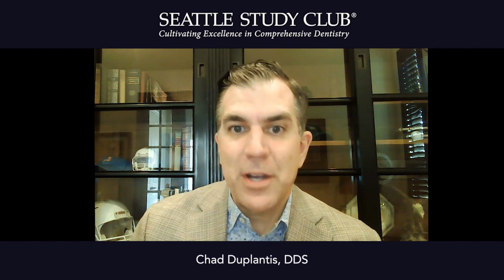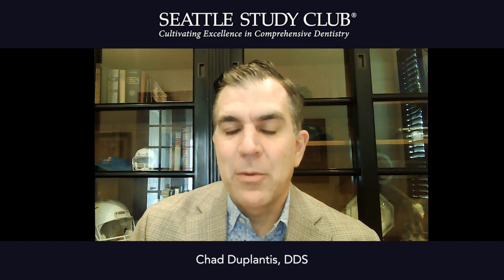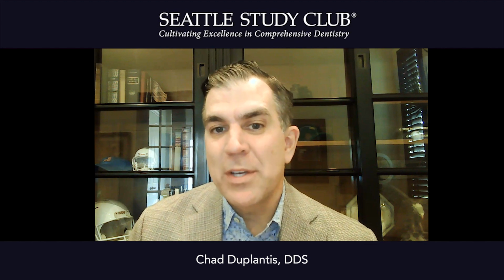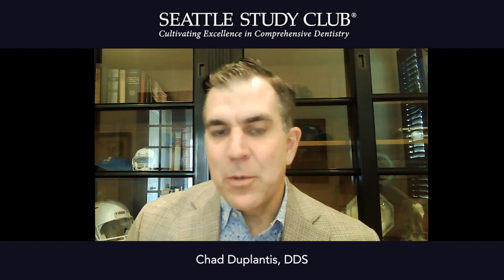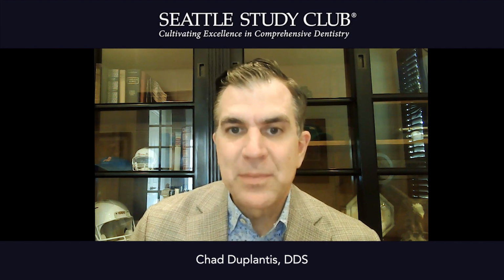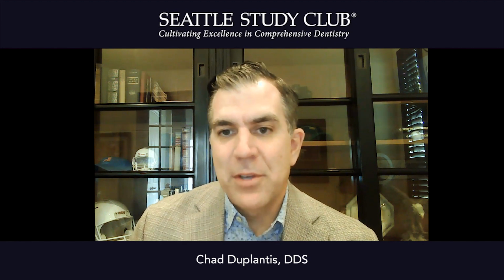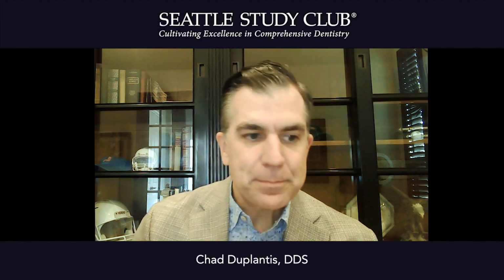The A stands for airway. The CBCT allows us to visualize the airway, and it's a great tool to help determine the risk of a patient for obstructive sleep apnea. We can measure the airway utilizing the tools with the software from the CBCT, and in turn, we can create a volumetric analysis of their airway and determine if they're at risk of obstructive sleep apnea.